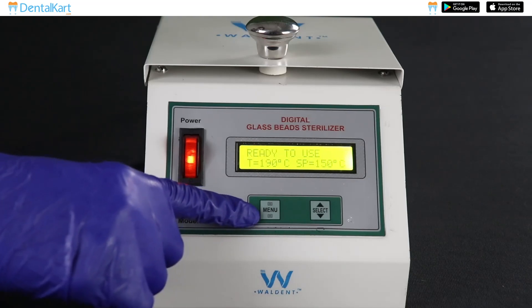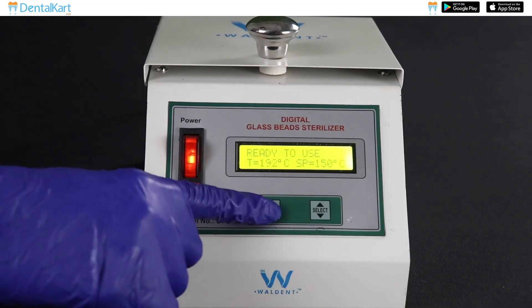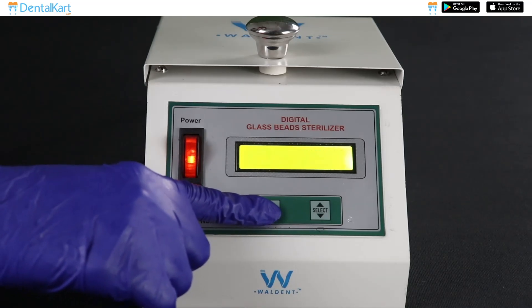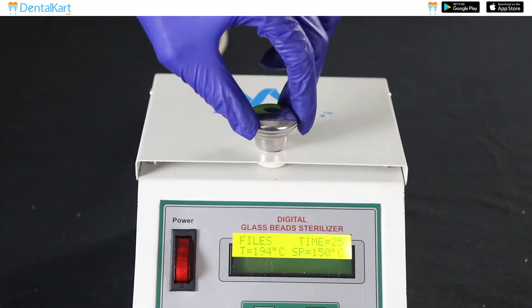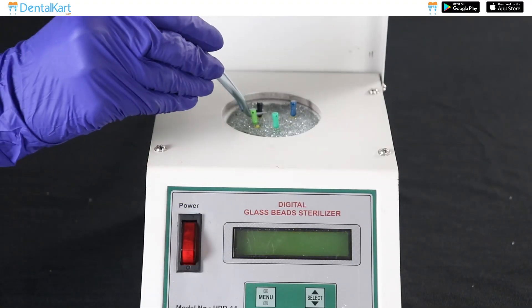Now press the menu button to select the mode according to the type of instrument to be sterilized. Immerse the working part of the dry instrument into the well of glass beads for the required time. Remove the instrument after the required time and the instrument is ready to use.